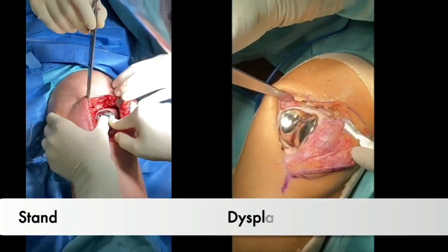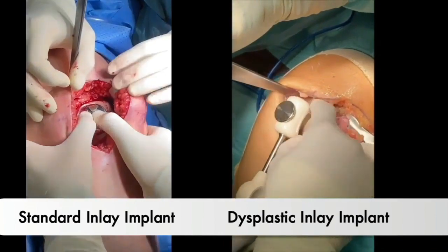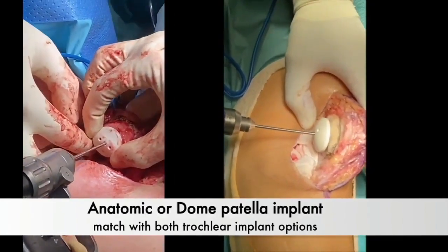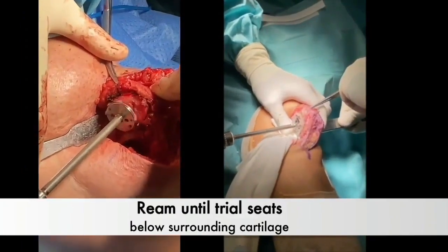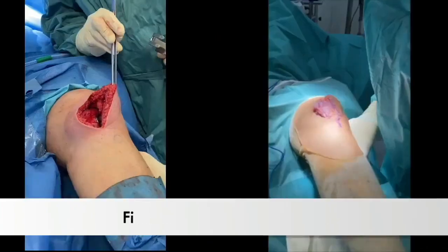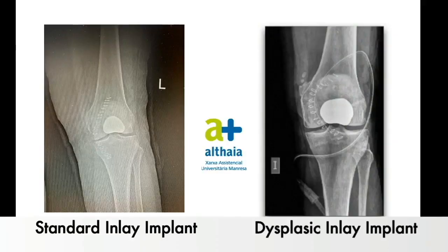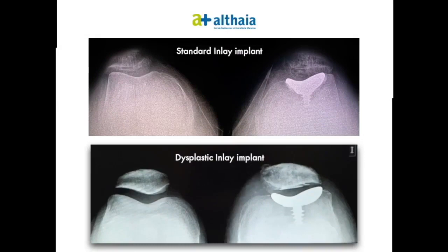In cases involving severe osteoporotic patients, preassembling the implants on the table is recommended. Final implantation involves a non-cemented approach for good bone quality, or surface cement application for osteoporotic patients. For the patella, we recommend the anatomic implant version for individuals with smaller knees and the dome-shaped implant for those with larger knees. Adhere to the steps delineated in this technique ensuring consistent cement application. Range of motion is then assessed, and post-operative AP, ML, and 30-degree axial X-rays are taken to confirm implant positioning.